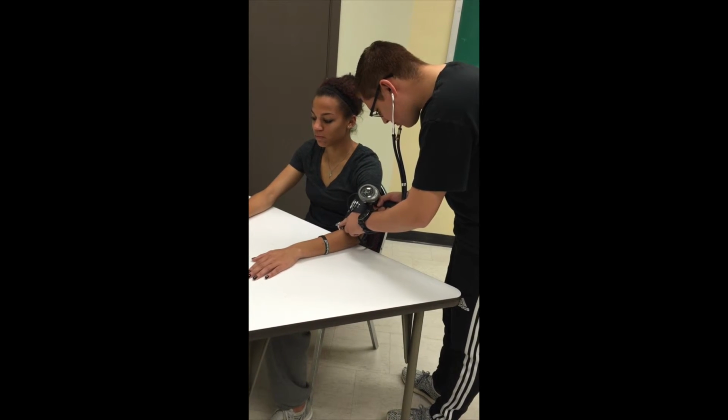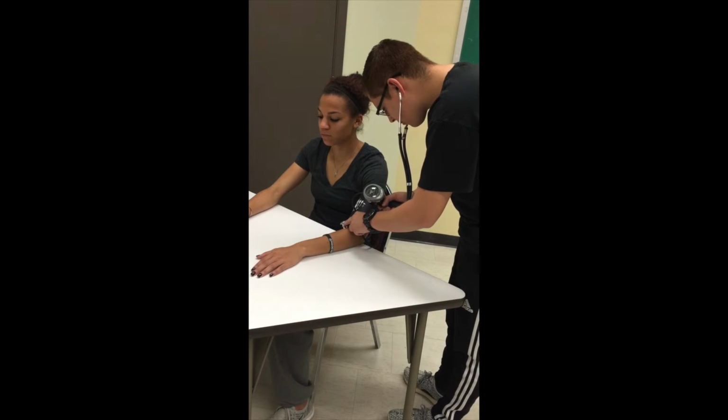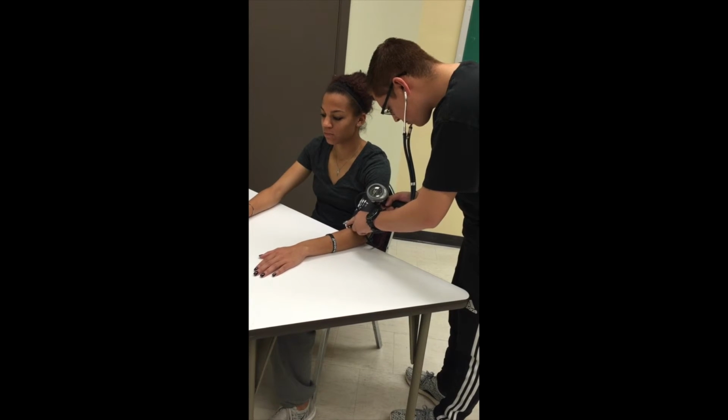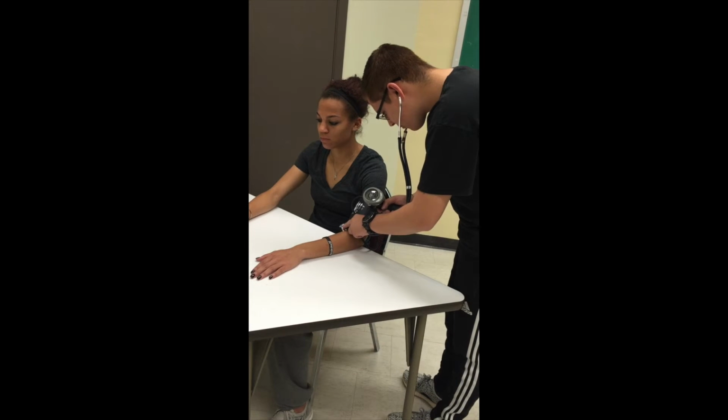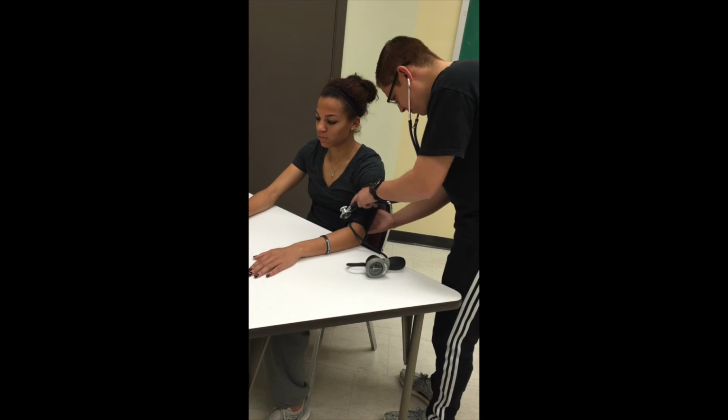Listen closely to the first sound, which should indicate systolic blood pressure, and the continuation of lub-dub that follows. The last sound indicates diastolic blood pressure. At this point, completely release the air from the cuff and remove the cuff from the patient's arm.